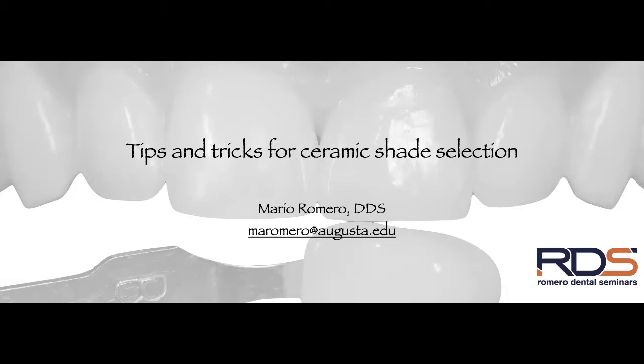As I'll show you in my presentation, we can all agree that a lot of our cases, when there are multiple restorations involved or they're larger cases, are a lot simpler, because we can choose whatever shade we want and have all the teeth made with the same shade, and we'll be very well off at the end of our case.